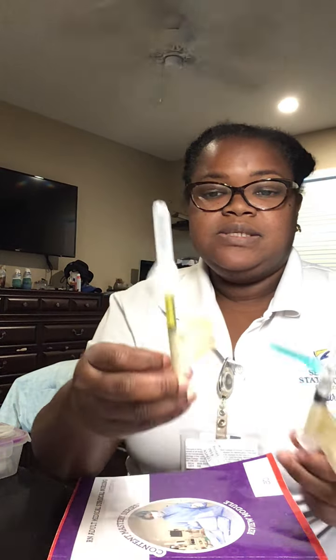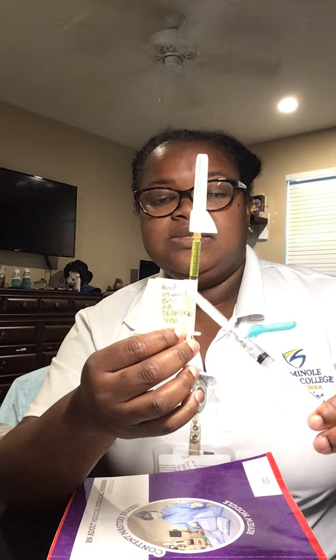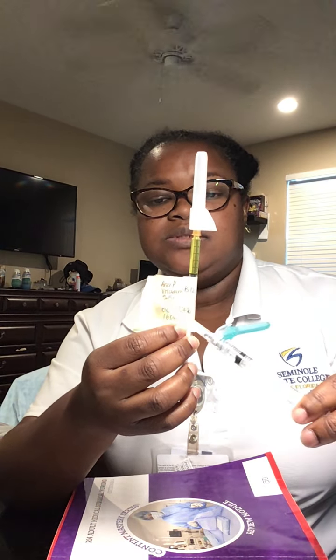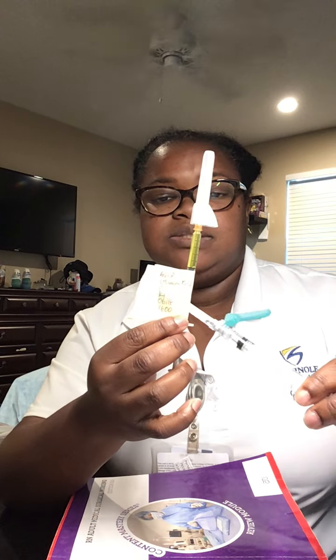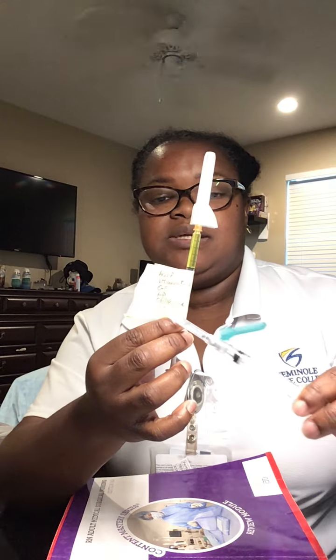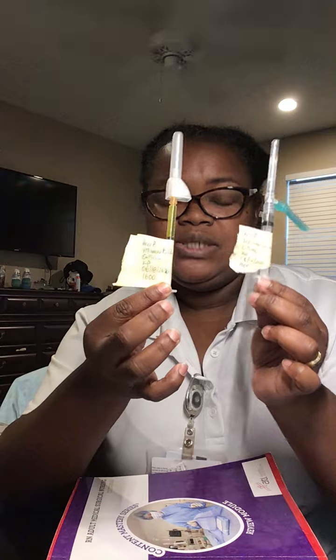Okay, now the same as I did with this one, I put my patient's name and B12, vitamin 12, that I'm going to give you subcutaneous. The amount is 0.5, my initials, the date, and the time I'm going to give it. Both are labeled.